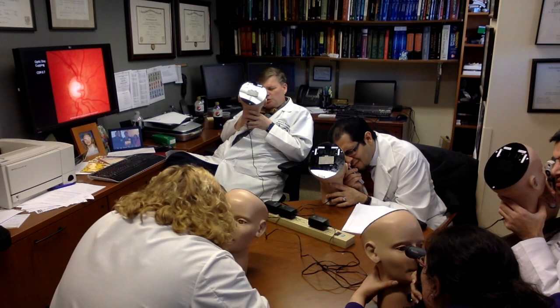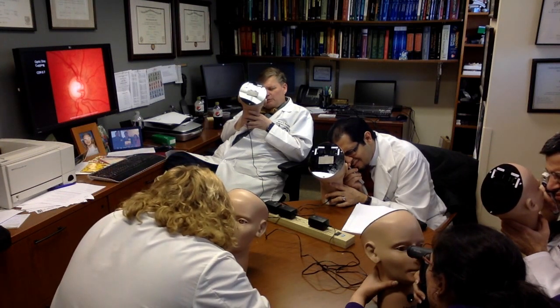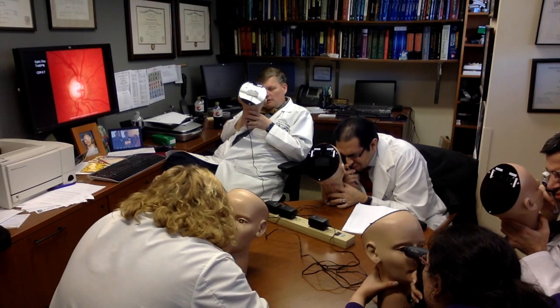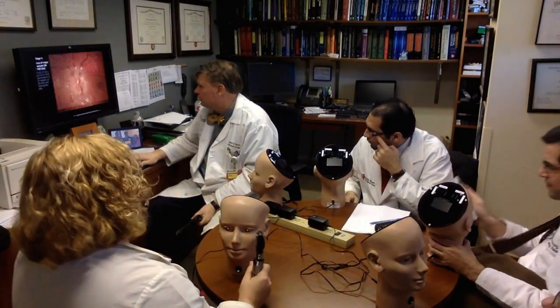If you look extremely closely at a very small artery at approximately 9 o'clock, it's a small one, same story. It comes up, a little bump up, runs down, and then over. Do you believe that? Yes. Okay, good. So this is papilledema.